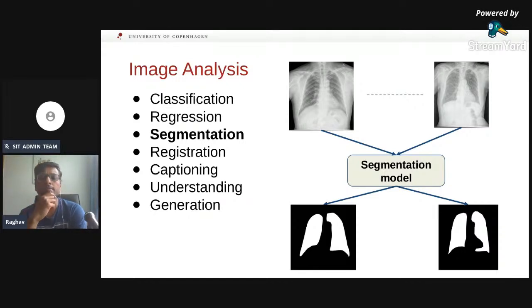So this is a useful intermediate step if you can focus only on the lung regions. Segmentation is basically the task of splitting your image into meaningful partitions. Now, what are the regions here? The lung region and the background region, we would call. So this is the intermediate step, as I said, in the pipeline, if you want to build an automated machine learning algorithm which focuses within the lung region and then performs different sorts of analyses.